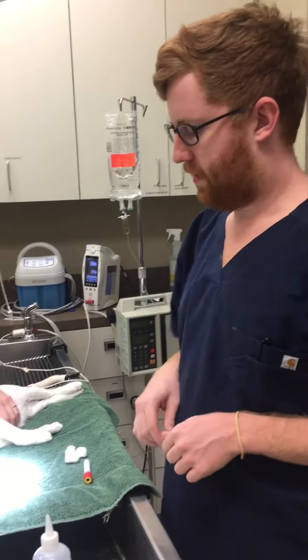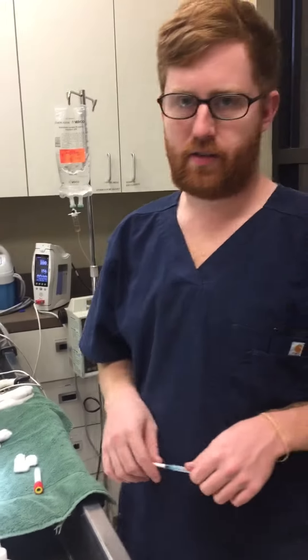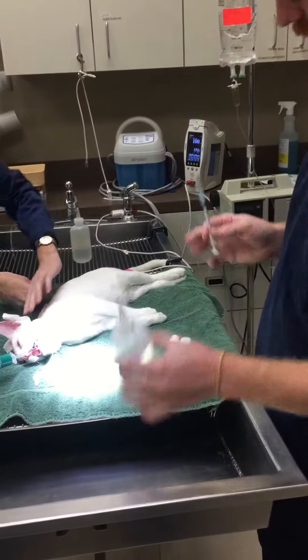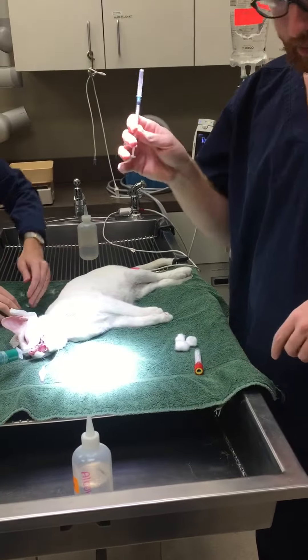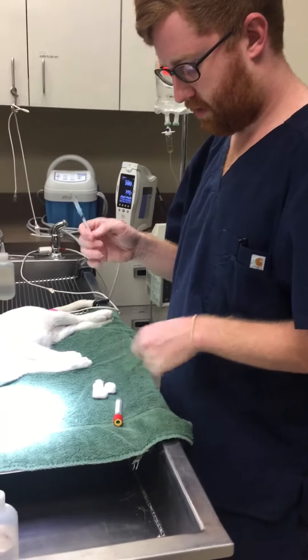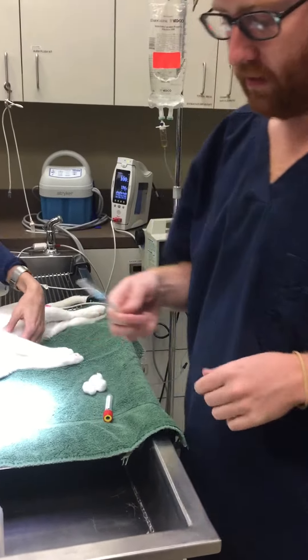Hey, I'm David Mullinex, and I'm going to be demonstrating a feline jugular venipuncture. I do have all the equipment necessary at hand. I have my alcohol, I have an appropriate size needle and syringe, I have a properly labeled blood tube, and I have my cotton balls.